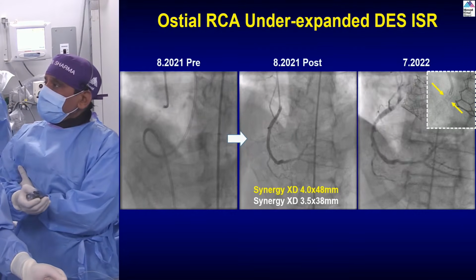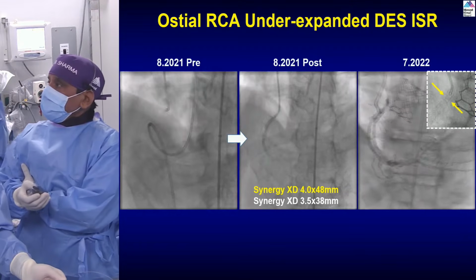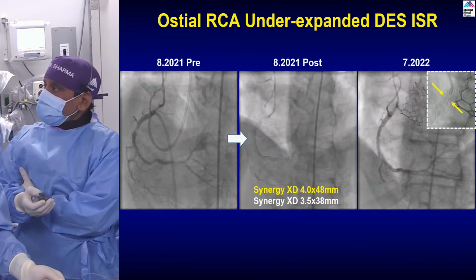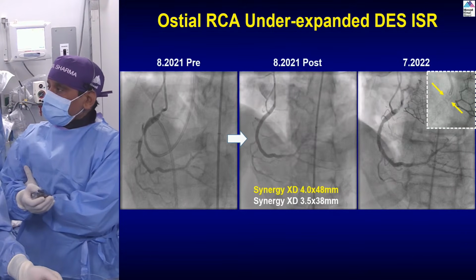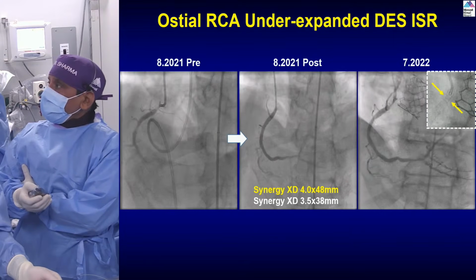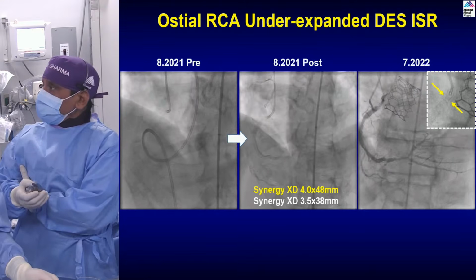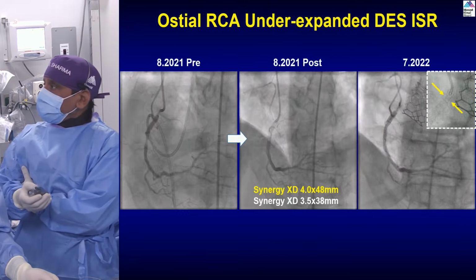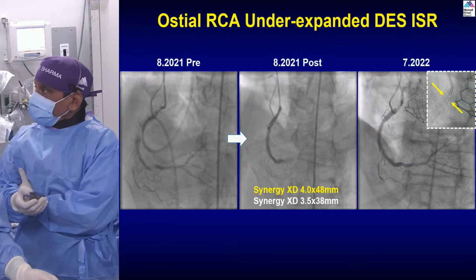As you can see, multiple lesions in the ostial and mid to distal RCA. At that time the patient had a rota plus stent. Look at the very nicely placed and expanded stent at that time. Now you see not only stenosis, there is ISR of the proximal part and ostial, but it looks like there is extrinsic pressure, compression of the stent.